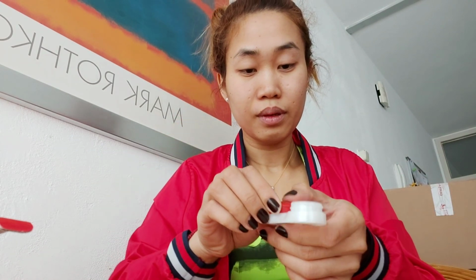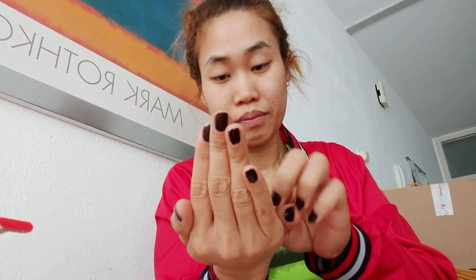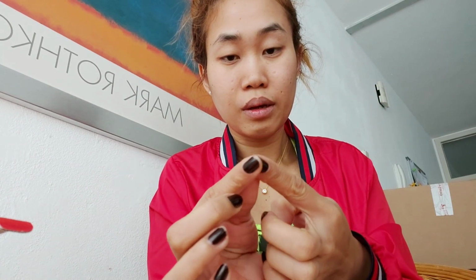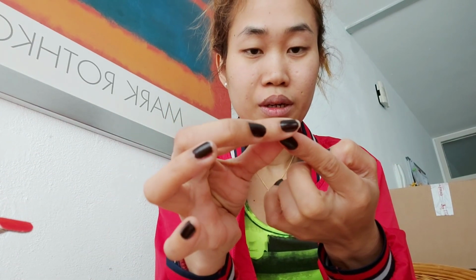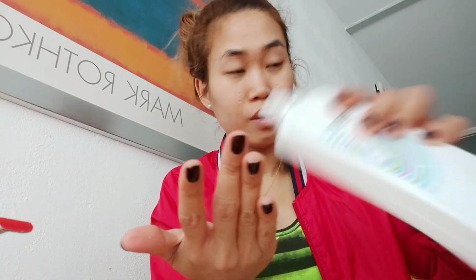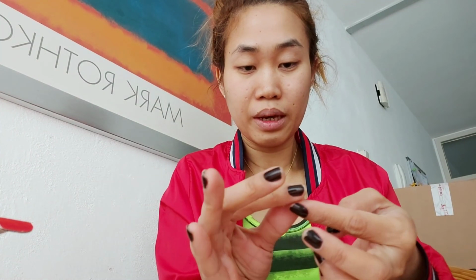So the first thing, I have a tissue with me. I will put on my right contact lens first. Make sure to wash your hands, guys. If you are not used to it, you should do it like this. Put it, and then make sure that it's like that, guys. Okay, make sure that it's centered here. With me, I'm used to it already, so I just demoed, guys, but first make sure that you put enough solution and wash it again, so you are sure that it's clean. So do it like that, guys.